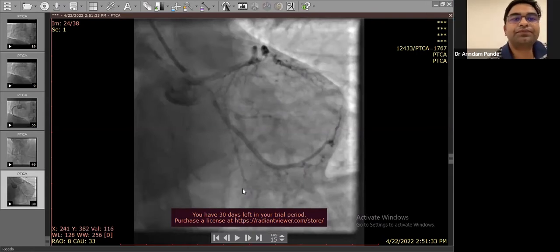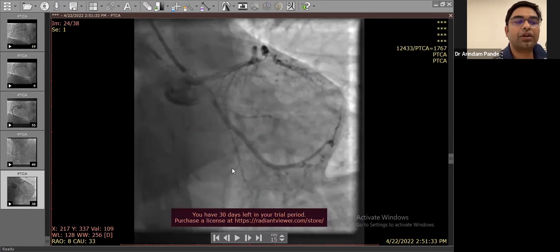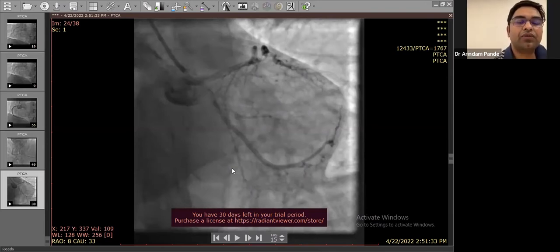Basab, fantastic case. Only a few comments. You retrieved the dislodged tip of the catheter very nicely. Which part of the dislodged tip did your wire go in? Because that is very important. I think your wire went through the middle or hole of the distal tip of the catheter, because otherwise, if you inflate the semi-compliant balloon and it is not going through the hole of the distal tip, then it would have been dislodged in the aorta. So that is one personal observation. I would like to understand your view as well.